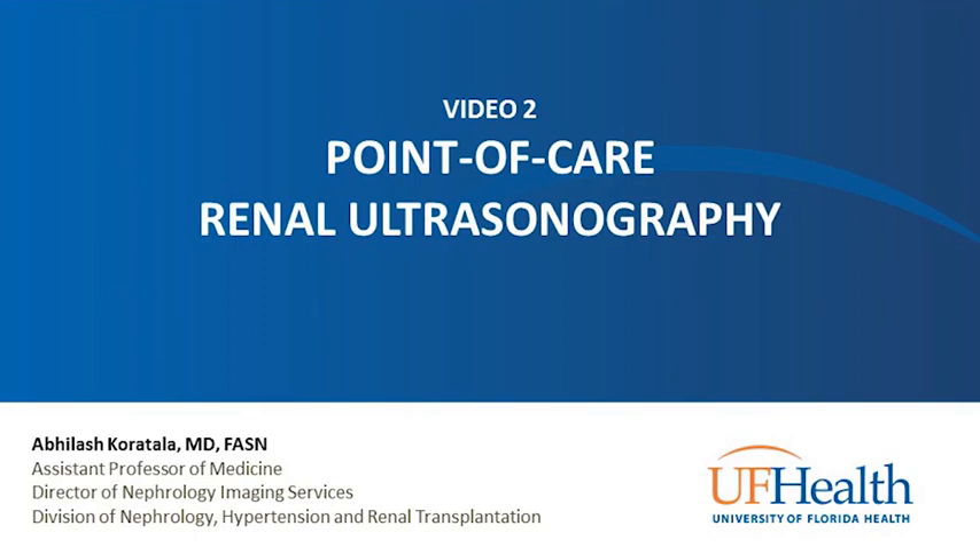In this video, I'll demonstrate the renal ultrasound procedure, including acquisition of longitudinal and transverse views of the native kidneys and urinary bladder. I'll also briefly demonstrate the renal transplant ultrasound and the renal resistive indices.